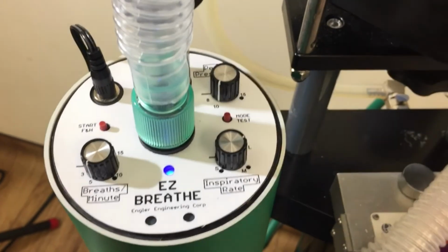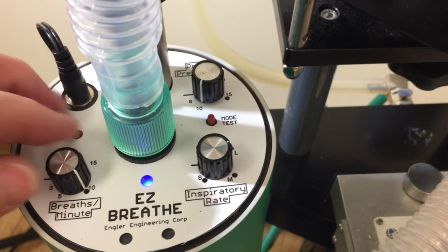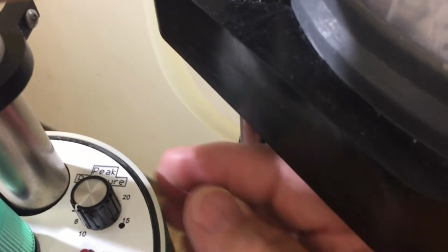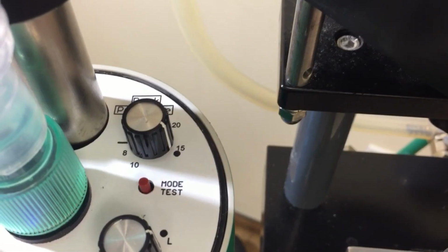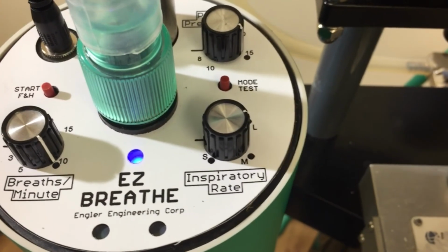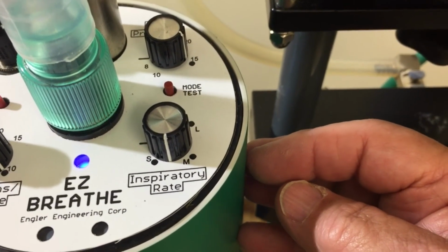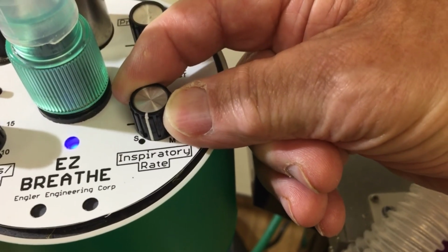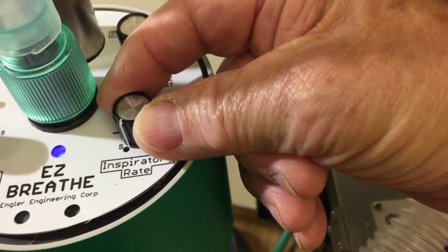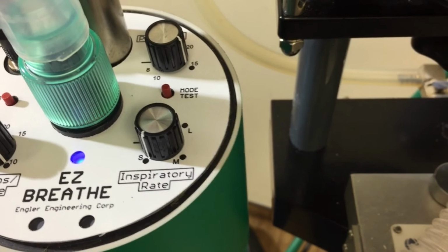To adjust the controls, first set the breaths per minute. In most cases, setting the indicator to the dot at about 10 breaths per minute is fine. The peak pressure is also set to the dot, which is about 15 centimeters of water, which is appropriate for the vast majority of patients. The inspiratory rate is set according to the size of the patient. At this time, it is not very critical to get started, so set for S, small, for patients in the 10 kilogram range, M for medium in the 20 kilogram range, L for large in the 30 to 40 kilogram range.